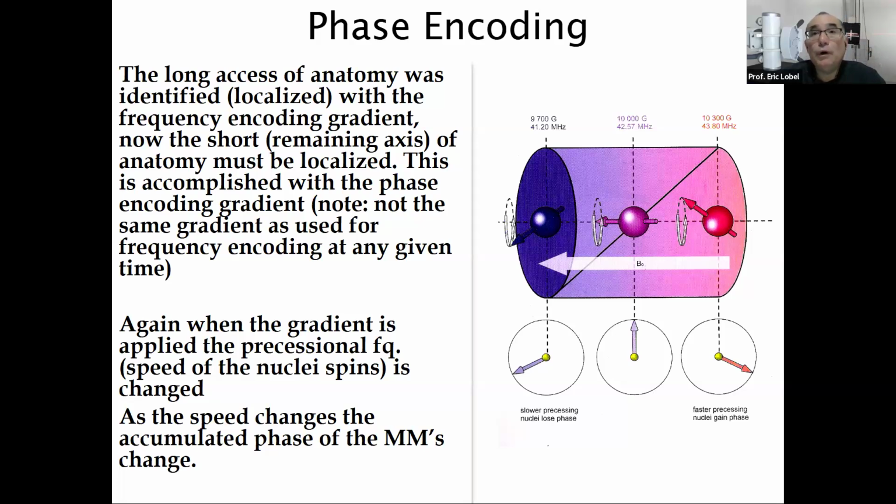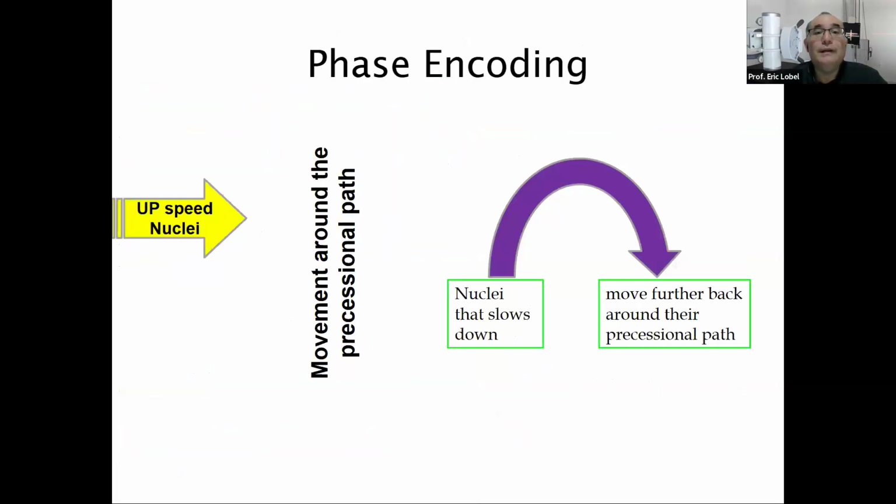There is more than one way to fill K-space, but generally it's a gradual start from the top and we tick down, right? In my analogy from before, it's like pushing that seesaw down to the ground and then lifting it up a little bit at a time, right? So that the other side goes down, down, down, down, down. And that's essentially how phase encoding works, right?